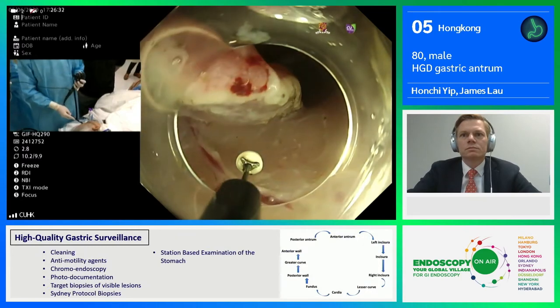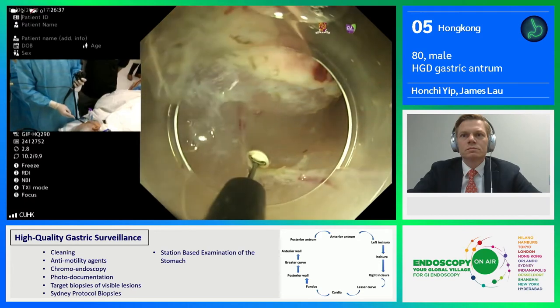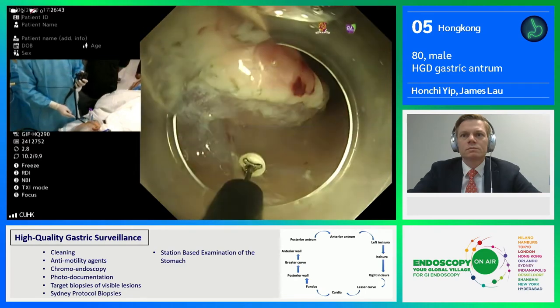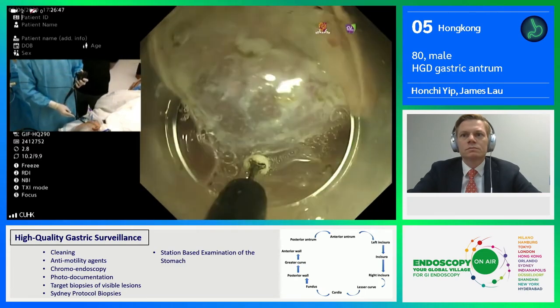I would like to coagulate this vessel — just slowly put pressure onto it, but not too much pressure. Just slowly coagulate it, and you will have good hemostasis even without the need for coagulation forceps.